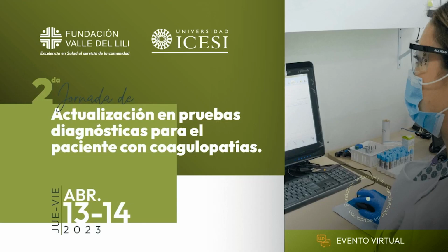That's a fantastic question. And the answer is yes. A TEG can be run at actual body temperature as opposed to corrected temperature.